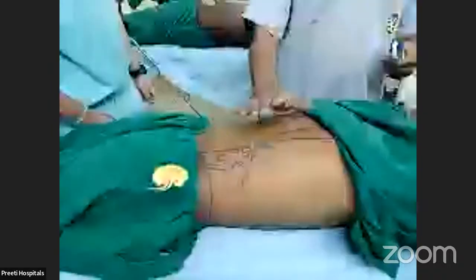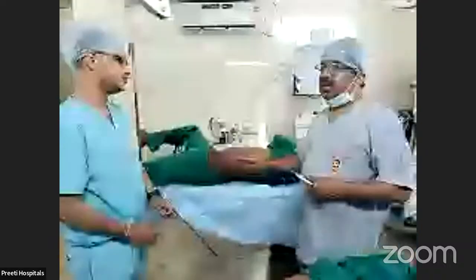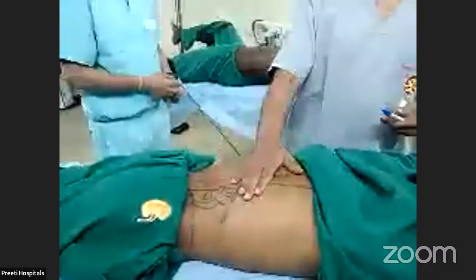Here you will attack the peripheral part, the lateral part of the calyx. Here, the lateral part of the posterior calyx. Here, the superior part of the calyx. So in your choice, both are the same, but with one choice, even vertical bullseye, you can go to the most medial posterior stones.